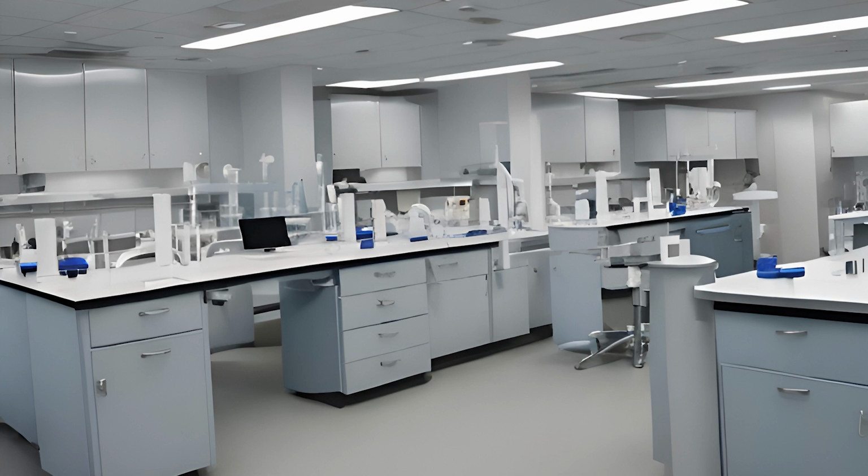To see blood flow, if you're using the evacuated tube system with a straight needle, you have to put a collection tube onto the tube holder until the stopper on the tube is completely penetrated by the needle in the hub. Once you do that, you will then see blood flow. If you're using a syringe or a butterfly needle system, you'll see what's called flash, where a small amount of blood flows into a chamber in the syringe or the butterfly needle to indicate that you have successfully entered the vein.